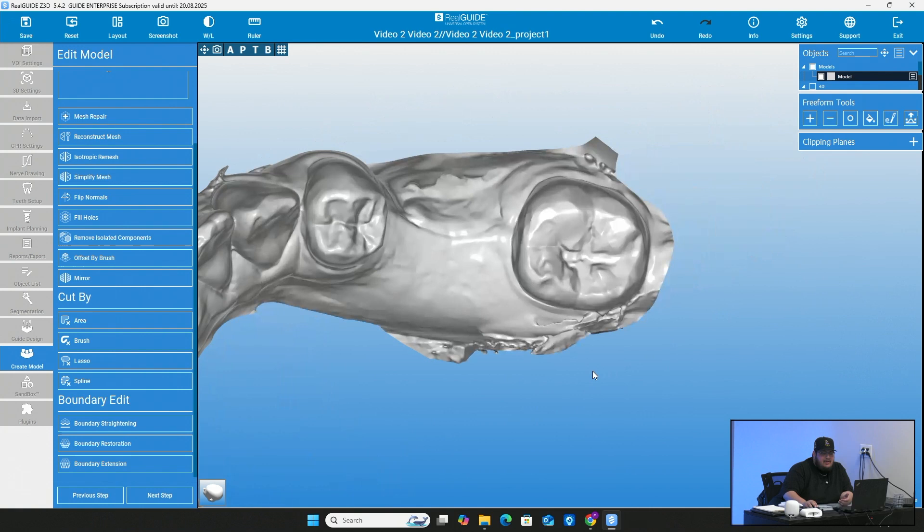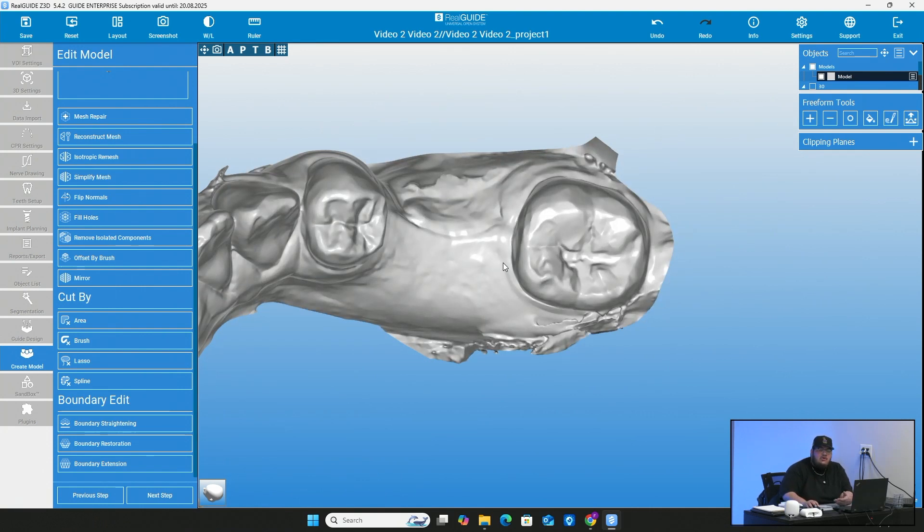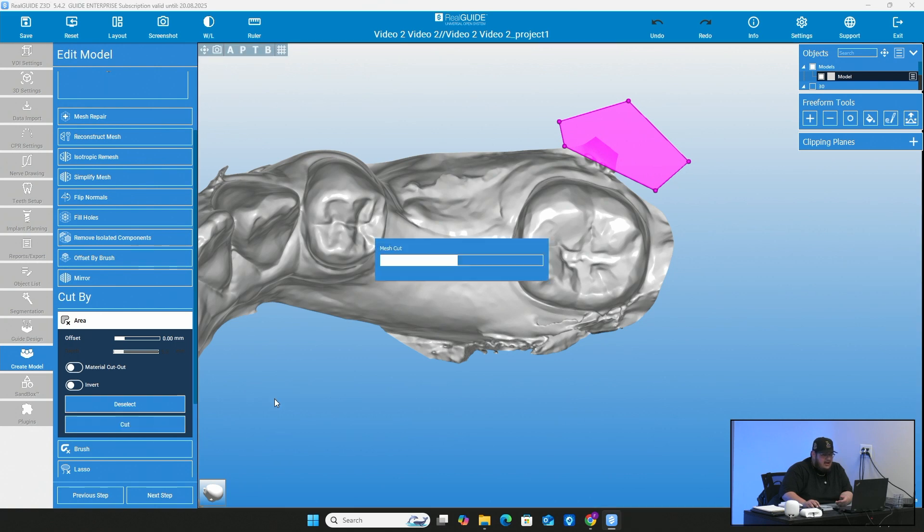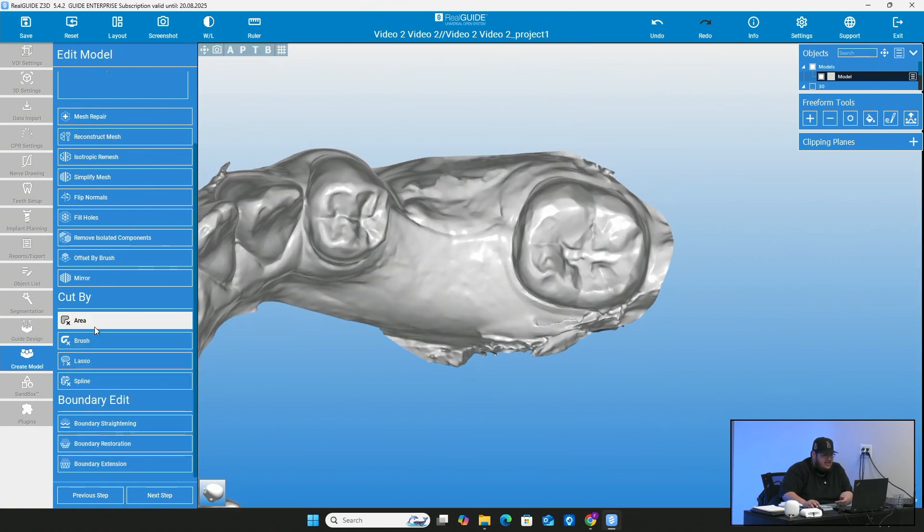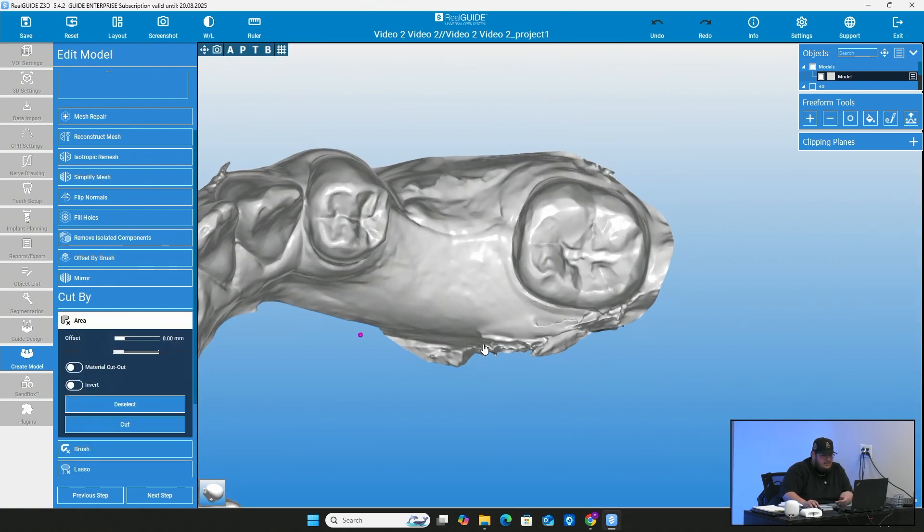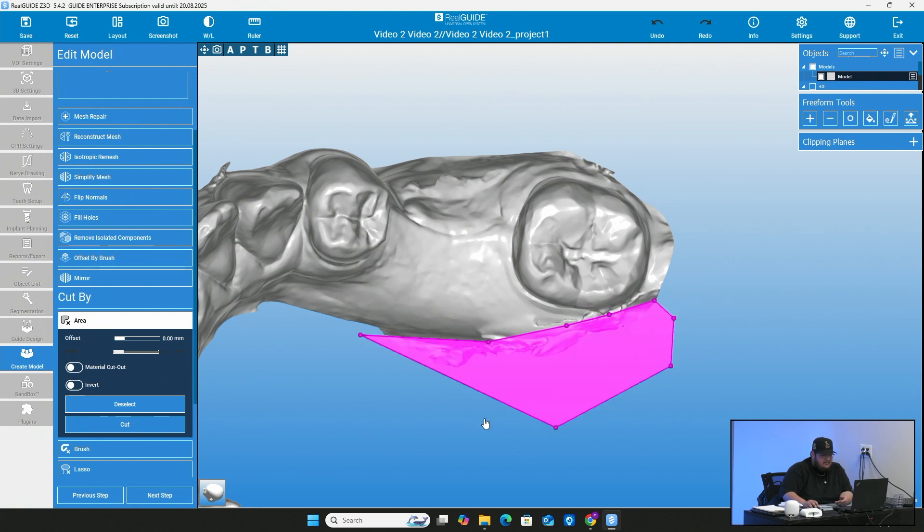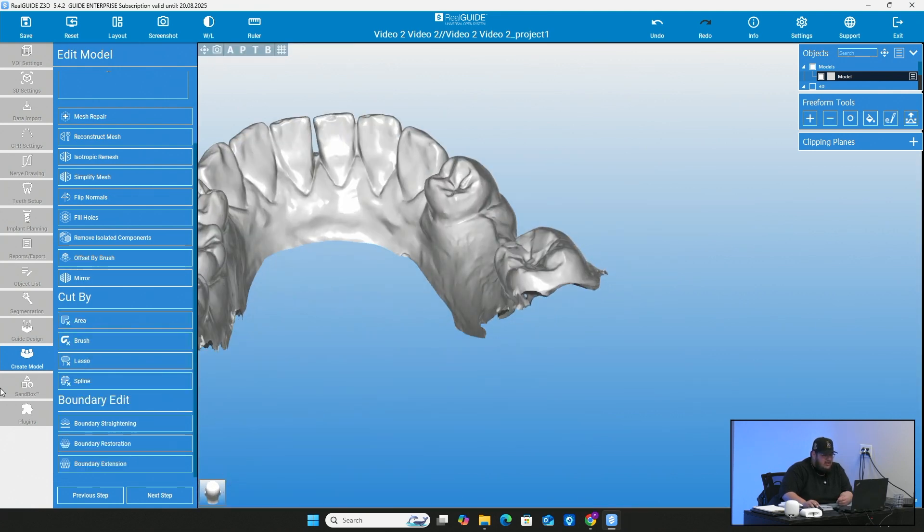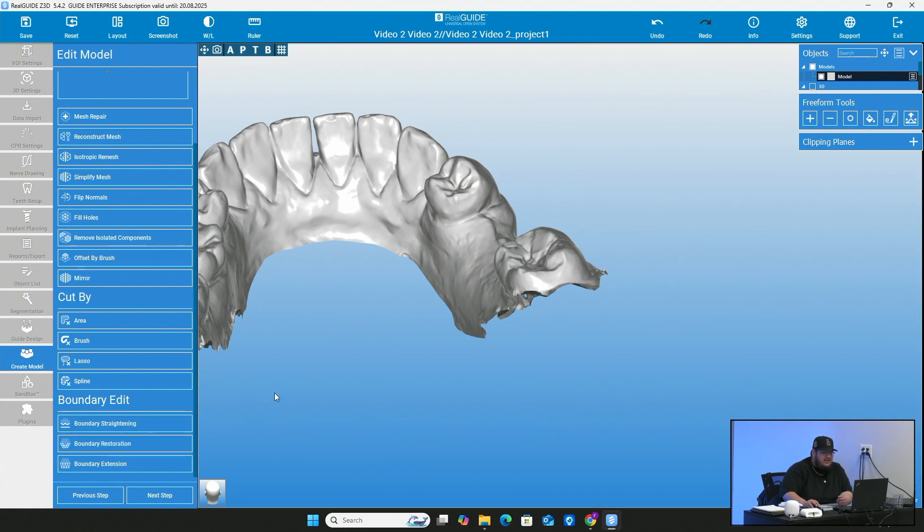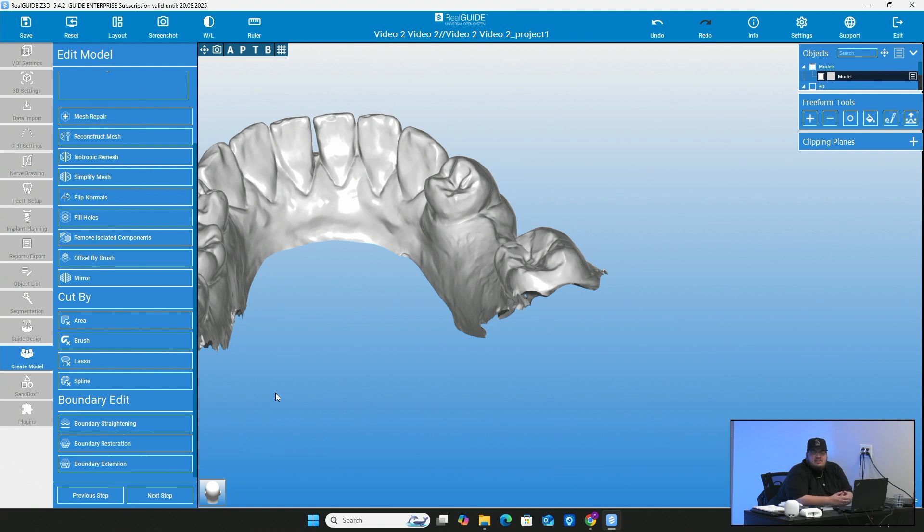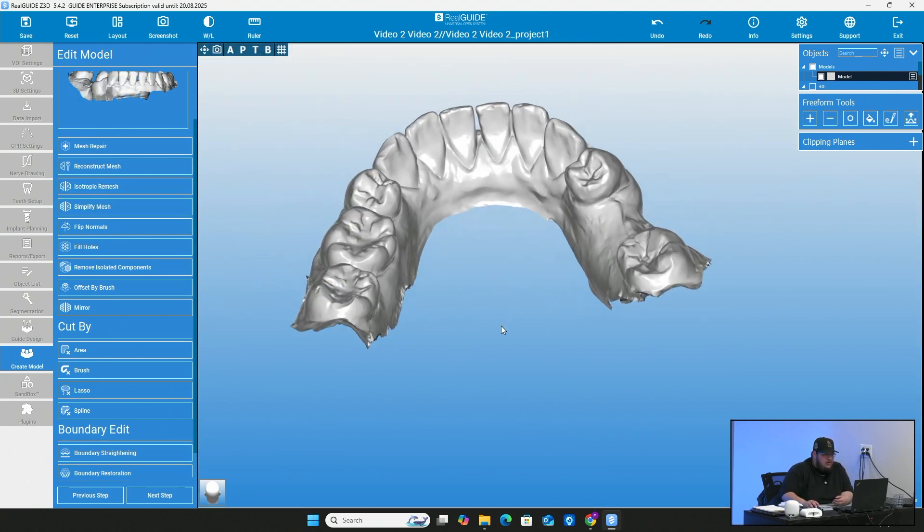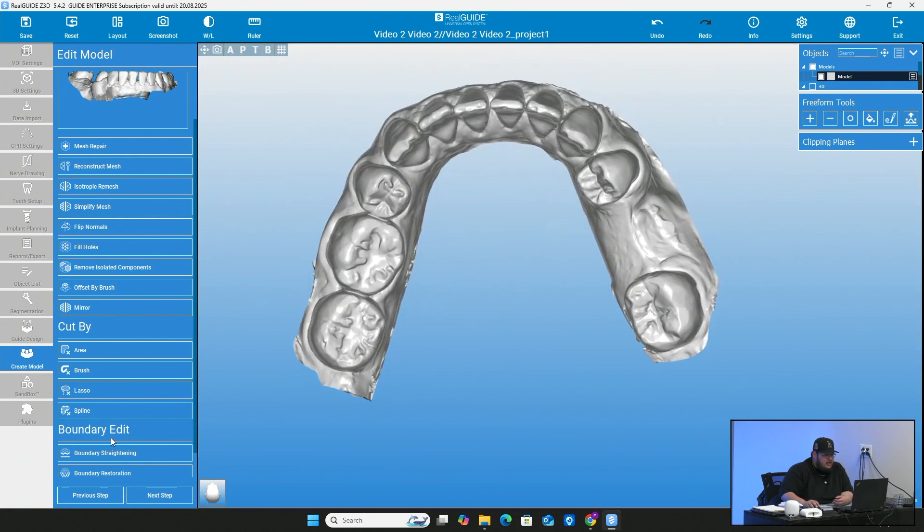You can do that realistically. The real reason to really go ahead and do that is sometimes the software just has an easier time in making the model. It doesn't take as long. Sometimes the software can have a hard time figuring out how you want the base of the model actually built based on this kind of scatter that's on the scans. So once you've gone ahead and you've edited your model the best that you feel fit, you're going to go ahead and go to the bottom and press next step.